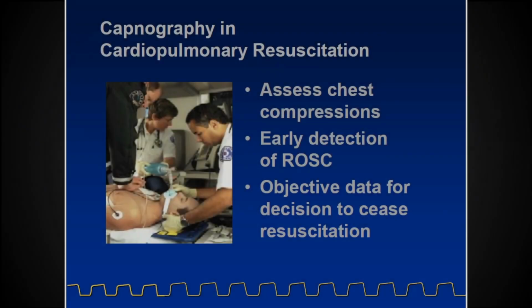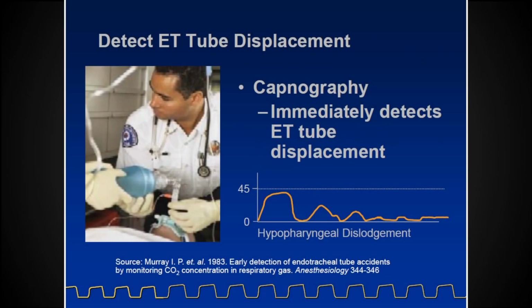Worst case, the farther you push an ET tube, it'll go into one lung, into a bronchi. So I guess maybe that's what they're implying. Yeah, I guess that's what they mean, is that essentially you've main stemmed the ET tube. But I would look at that and be like, oops, my tube has come out. That's what I would think.